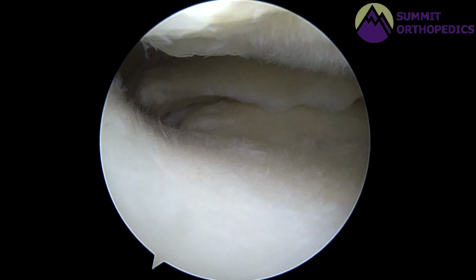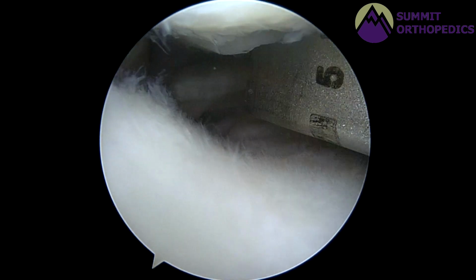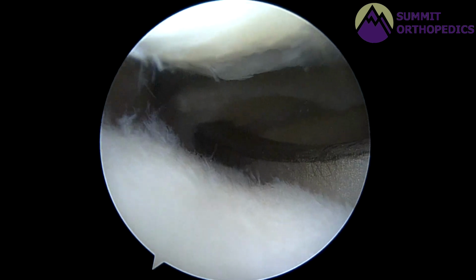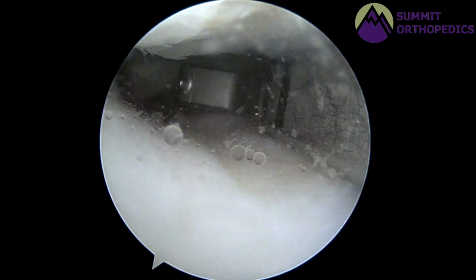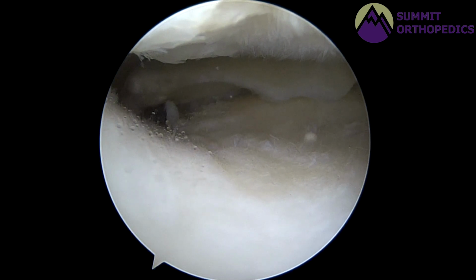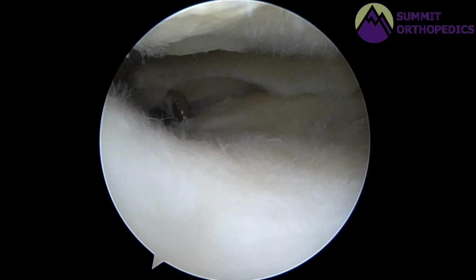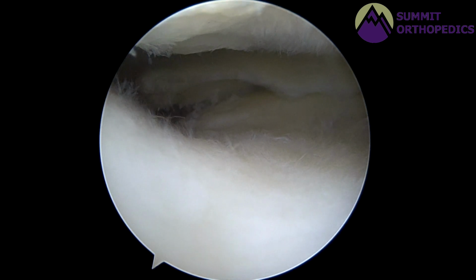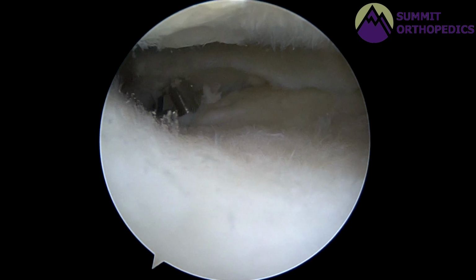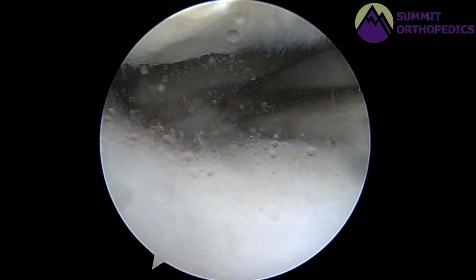Once that is prepared, I then insert a guide into the knee arthroscopically, and this guide is able to hook over the posterior aspect of the tibia to allow me to place a guide pin right in that footprint of the meniscus. Once I'm happy with my position of the guide pin, which is seen here, I remove the guide pin and then a reamer is placed, and this reamer allows me to create a small socket at the footprint, again to help with bleeding tissue for a secure repair.